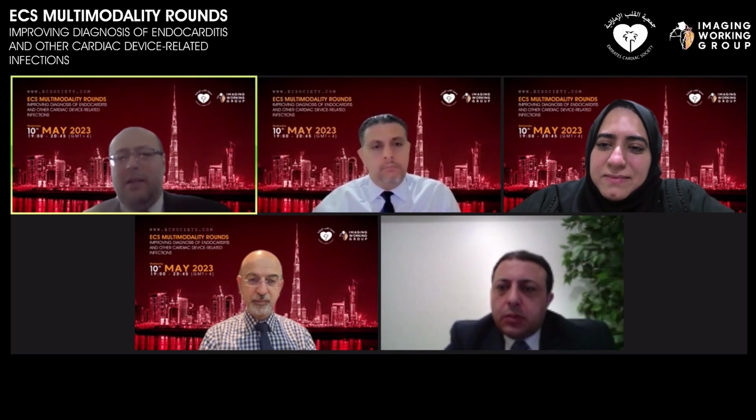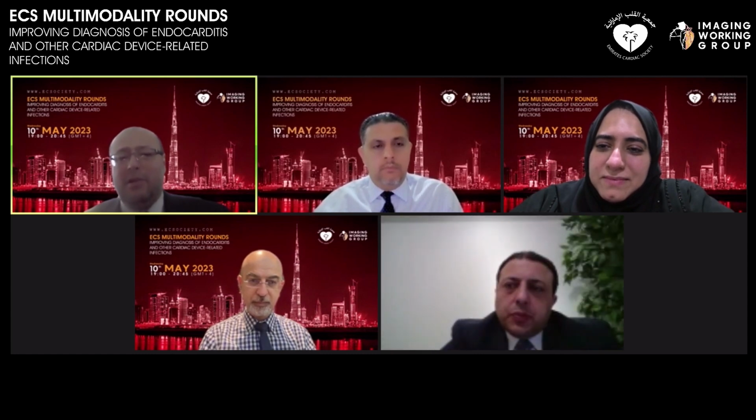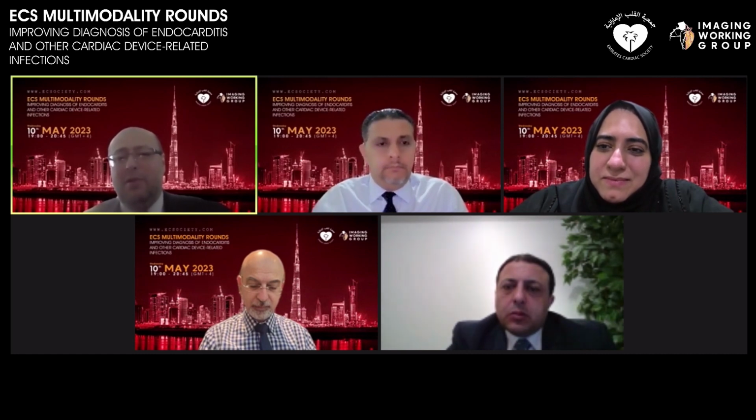This is compared with prior echoes. And if this is something new, the patient is febrile, then you may potentially go the route of either TEE, or CT, or FDG PET, depending on exactly what your question is. If it's just a mobile structure that you're looking for, TEE probably would be your best. If you're looking more for a local extension complication, something around the valve, then CT would be your best tool. And if there is something, but I don't know if it's active infection or remnant from before, then this is where PET could potentially help you.